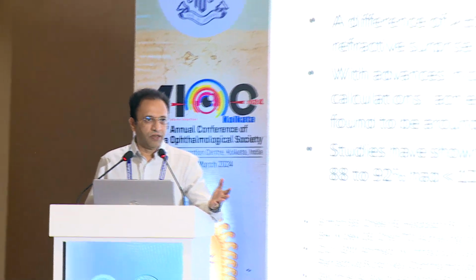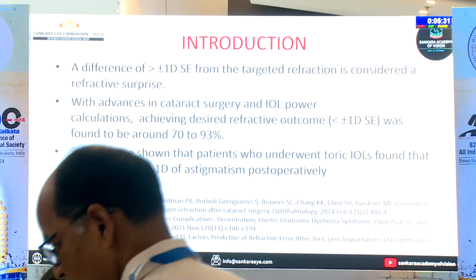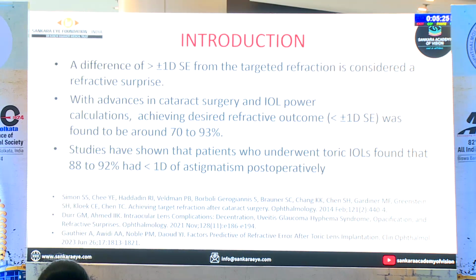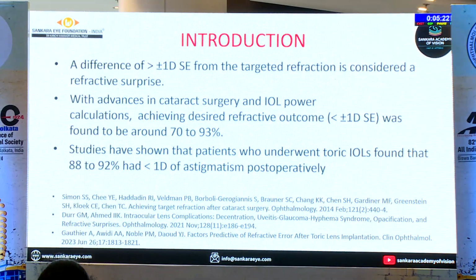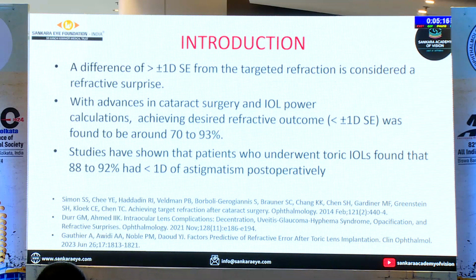The problem occurs once you cross the 2 diopter, 3 diopter range, especially if you are on the hyperopic side. That is when the patients create much of an issue. Though very uncommon nowadays with the advance of good biometries, we do see it. For those practicing premium IOLs, especially torics, up to 1 diopter is acceptable, 92% plus minus. With higher power toric IOLs, a leftover of 1 is acceptable. Out of 4, if 1 is leftover, you don't mind. But if you are operating on only 2 diopters, 1.5 diopter, that is when the problem occurs.